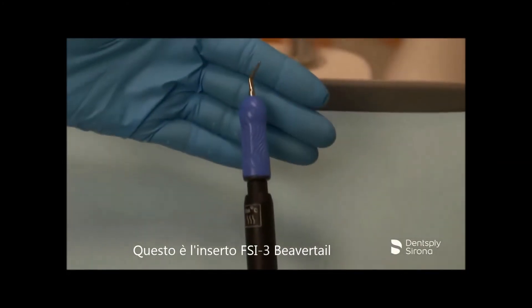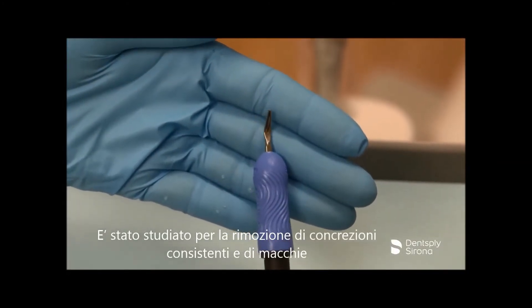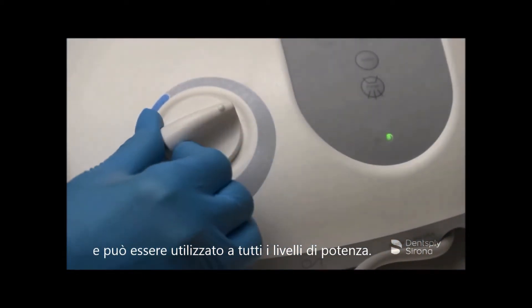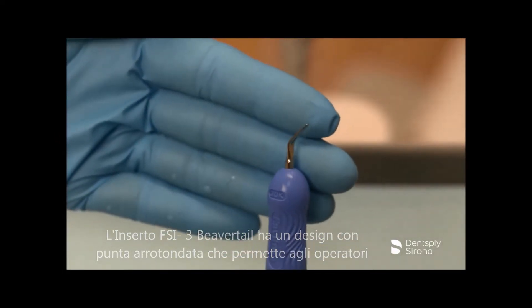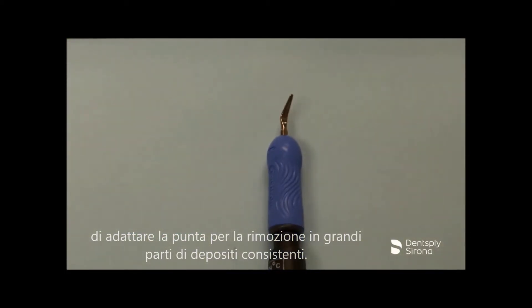This is the Cavitron FSI 3 beaver tail. It is designed for removal of calculus bridges and removal of heavy stain and can be utilized at all power levels. The Cavitron FSI 3 beaver tail has a rounded toe design which enables clinicians to adapt the toe for removal of heavy deposits in larger pieces and sections.